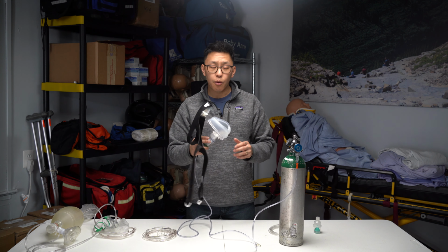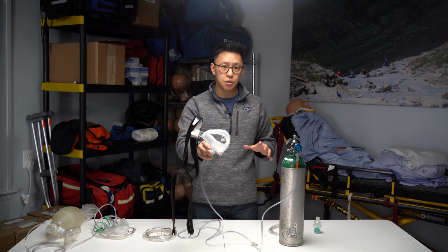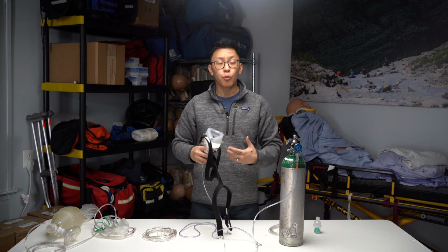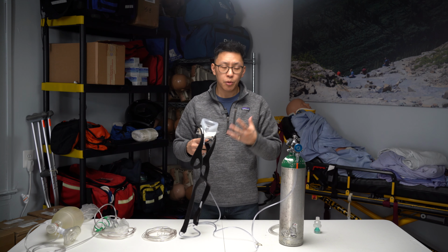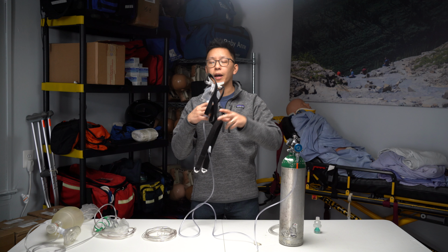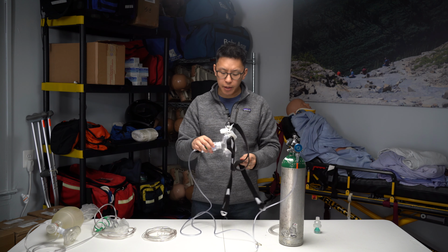And so once you turn it on, give it to the patient and instruct them to hold it to their face and try to create a good seal. And once they become comfortable, right, we're doing this to give them a sense of control, then we can apply the black straps over their head.